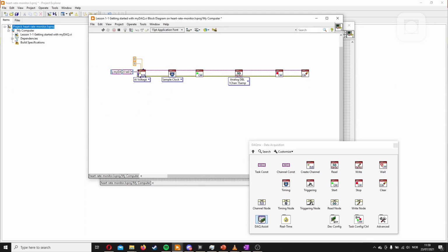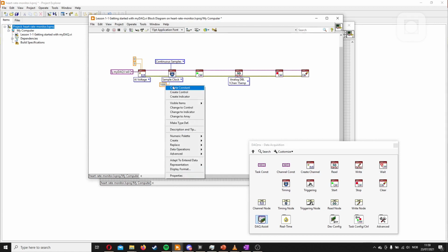Now we'll start a task which reads the analog input 0 and configures it to read it from 0 to 5 volts. Next, we'll have the sampling clock. So we want to choose a sampling mode. Finite sample means it only collects a certain amount of samples before stopping. But what we do want is just continuous because we want it to read until we tell it to stop. And secondly, we want the rate and we want 1000.